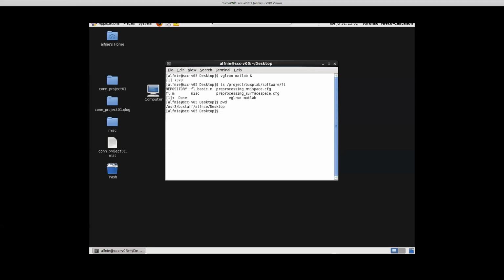Yeah, that does make sense. I think that, well, I may be wrong here, but Saul was thinking about when you do this thing, this resampling is not taking every subject and trying to morph it into the template. FreeSurfer already did that, right? So FreeSurfer already looked at the subject structural data, figured out how the sulci and gyri look for that individual subject, and it gave you a way to morph that into FS average space, a way to morph that into a brain that, when represented on the sphere, looks relatively similar to every other brain when inflated all the way to the sphere.